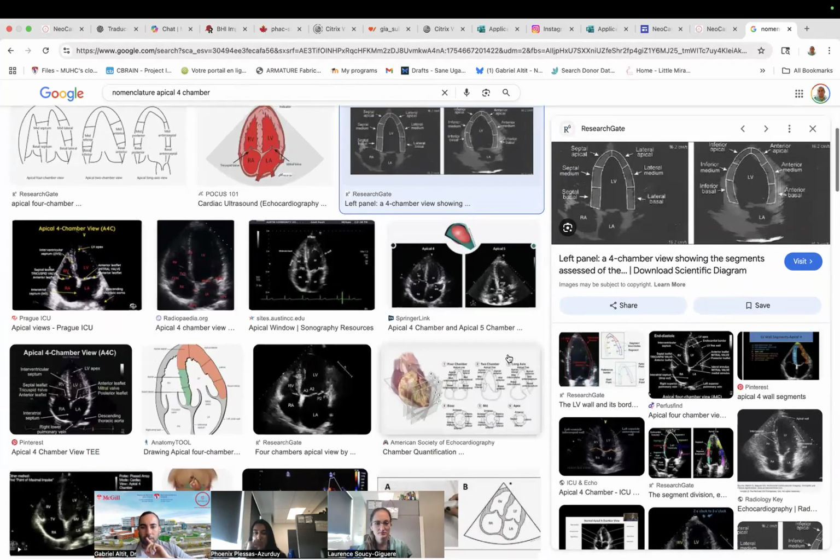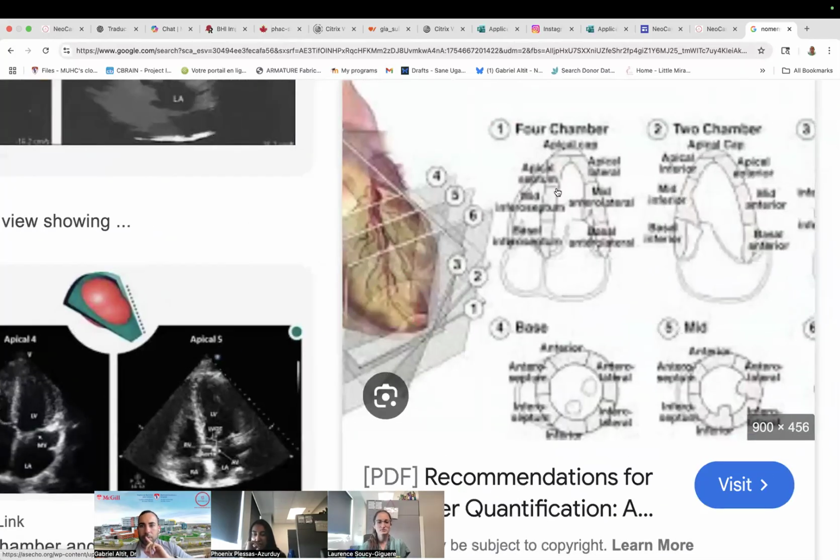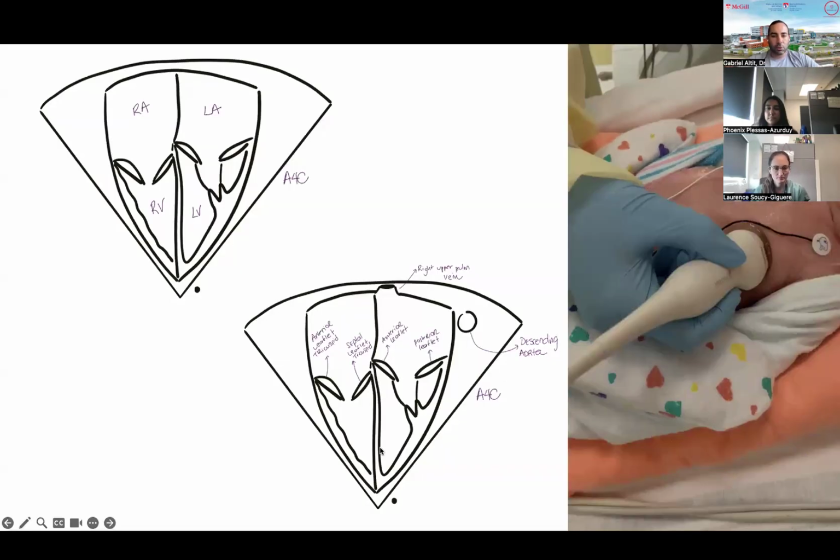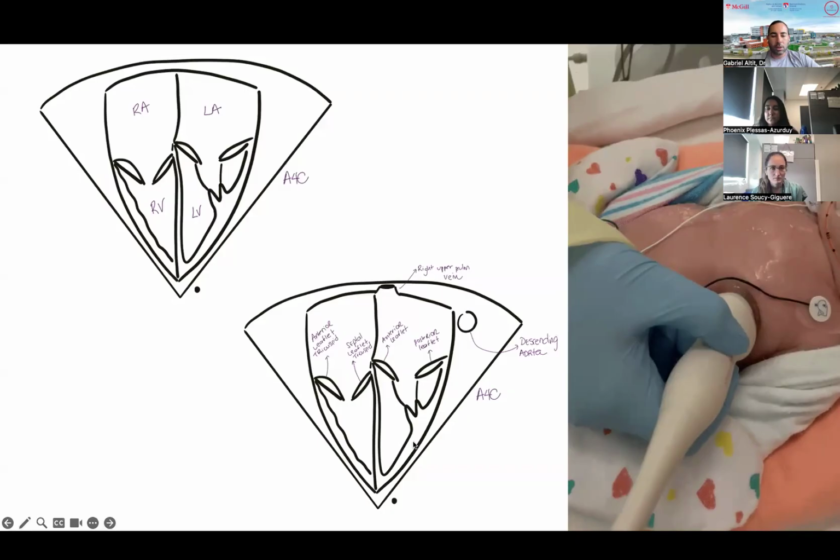Septal median. Okay, here. Anteroseptal, anterolateral. Okay, perfect. So I did lie to you. I'll show you where I lied to you. So here I told you this is more anterior and this is more posterior.